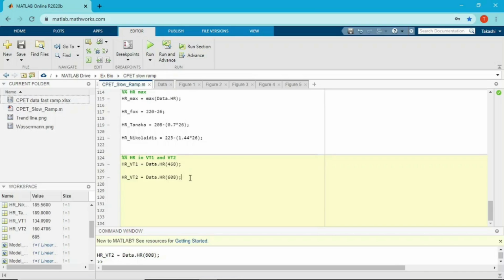But the point of the fast ramp test is to find VO2max. In contrast, in a slow ramp test, you cannot really find a reliable VO2max because as you exercise for a long time, you accumulate fatigue, and maybe your VO2max is underestimated. The fast ramp is fast enough to increase intensity, so you can remove the bias of fatigue accumulation and have a reliable VO2max.